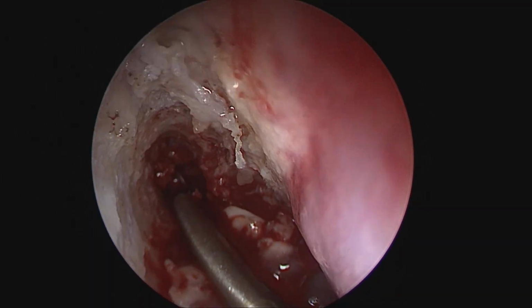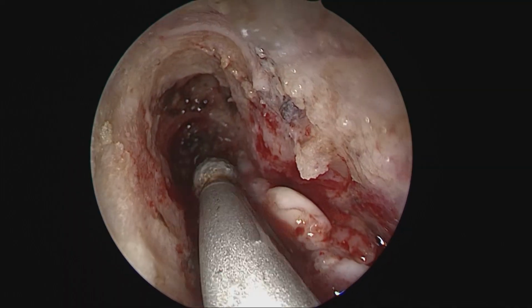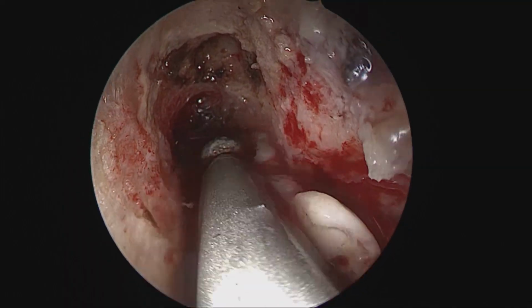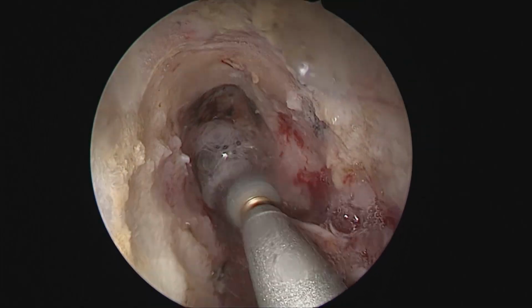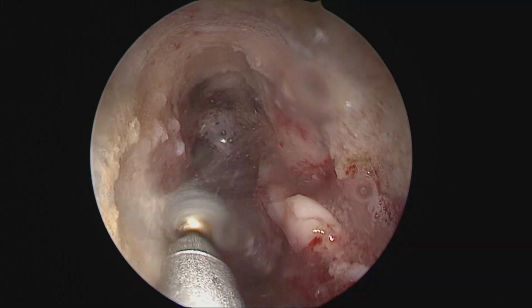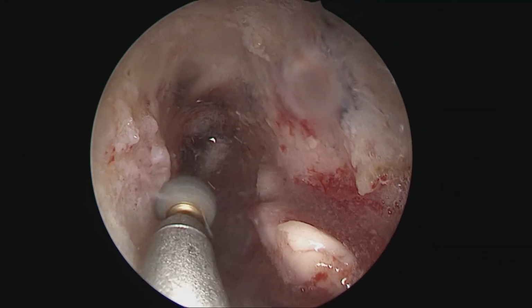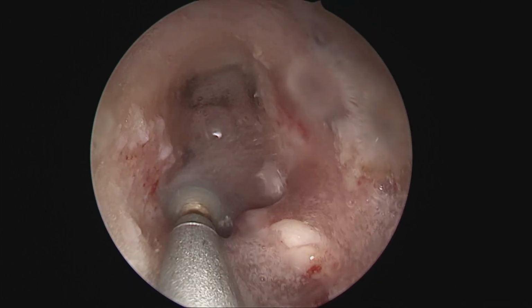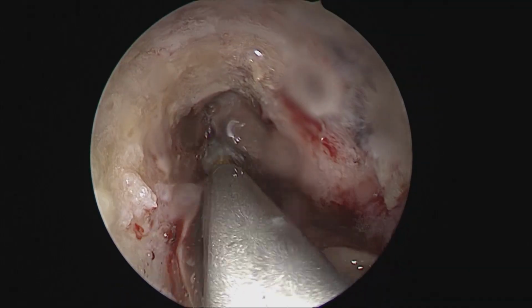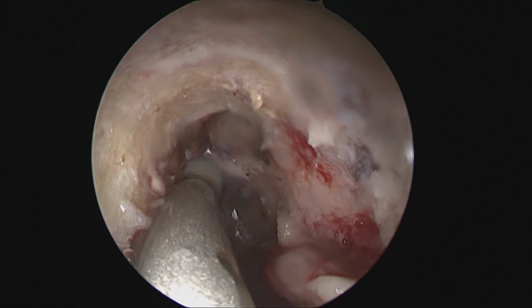Now, articulated bone punches are a wonderful tool, and they come in various angles and sizes. So, in an ideal situation, one must have access to all different sizes and angles for doing this step comfortably. But if that is not possible, and one is in a resource limited setting, having a 3 or 3.5 millimeter punch on a 70-degree or a 60-degree articulated punch is good enough, and that should be the choice as compared to the very steep angled ones, which although look good are more difficult to use.